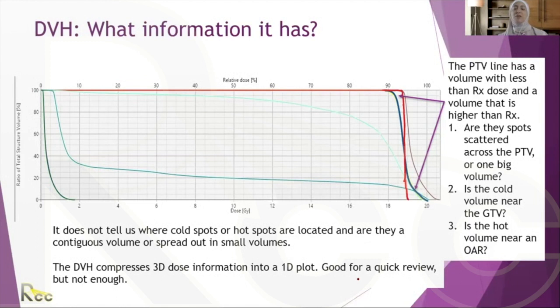oncologist. As physicists, we think of technicalities, we think of machine limitations, we think of all these things, but we don't have the human or patient concept of it. But it really is a back and forth between the radiation oncologist and the planner. It's a nice dance, I would say. And the good thing, if you have two good dancing partners, is if you can understand what your physician likes to have, and if the physician knows how the physicist does the planning.